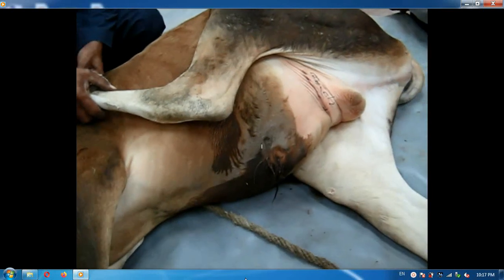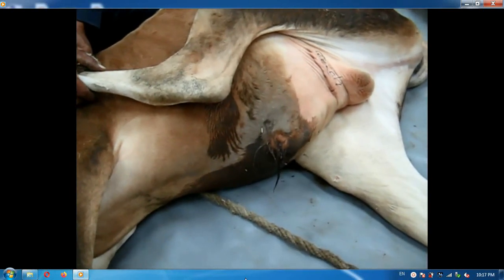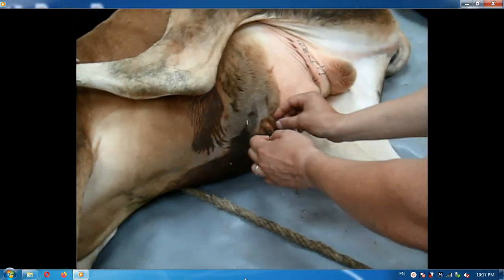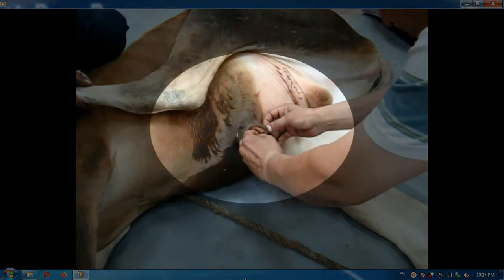The animal was treated by urethrotomy, dorsal urethrotomy, and laparotomy, followed by passing a catheter from the bladder to the external urethral orifice, and fixation of the catheter for approximately 3 to 7 days.